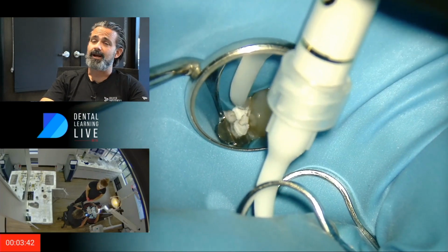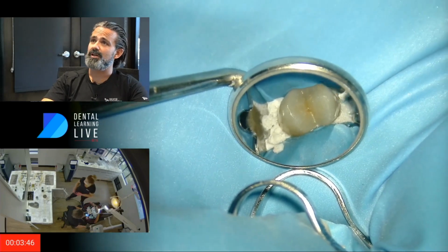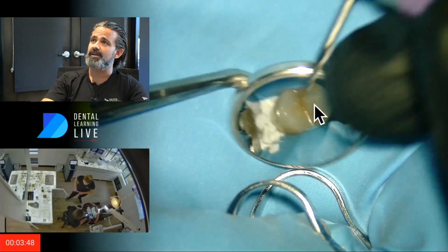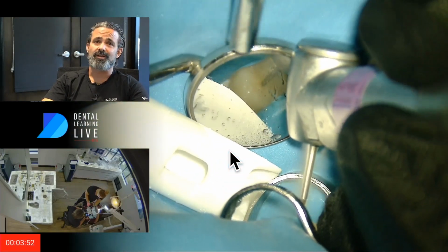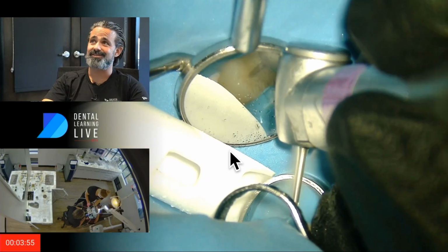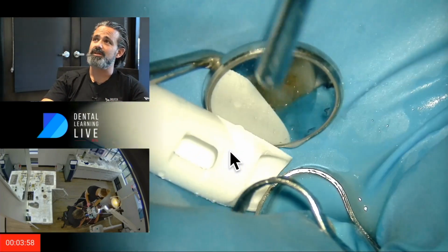So I use the butterfly clamp, and that's been put on, and you can see me working down here. I also always use that caulking. I think it's just something that I love, so I use it. It kind of pushes the rubber down apically.